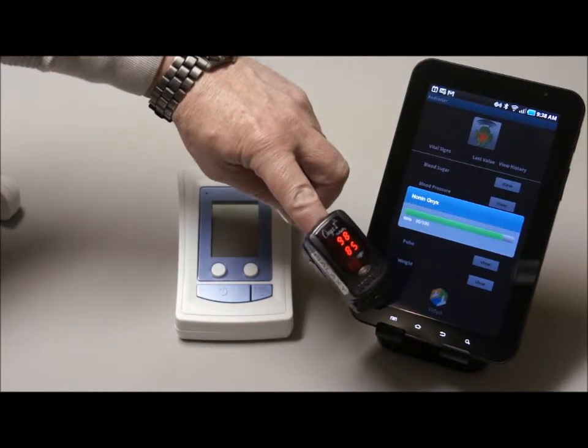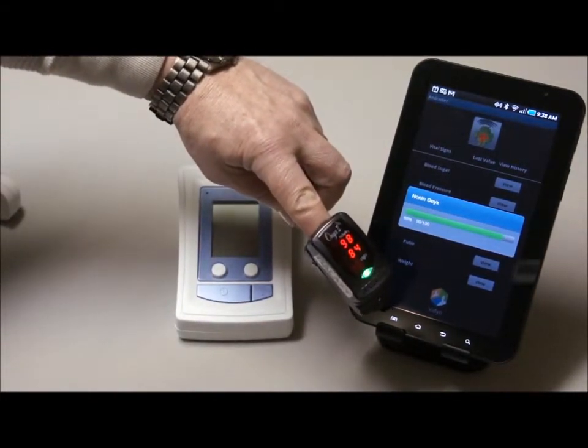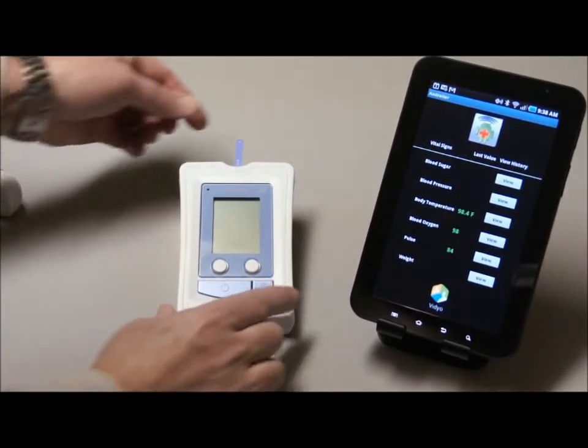Connected to the Onyx. Measurement acquired. Measurement stored. The next test we'll perform is measuring the blood sugar.